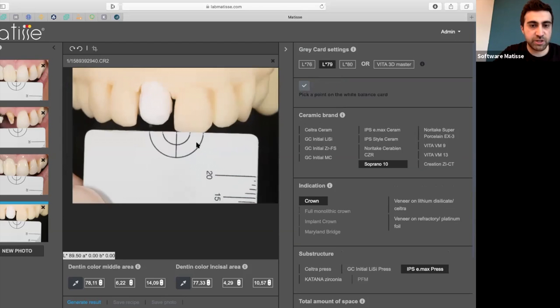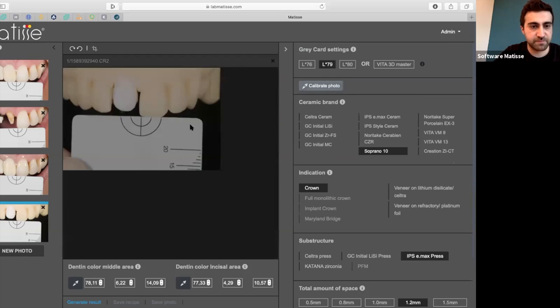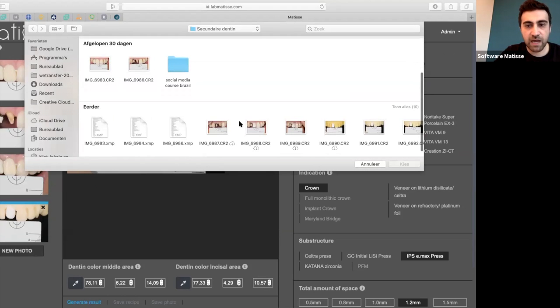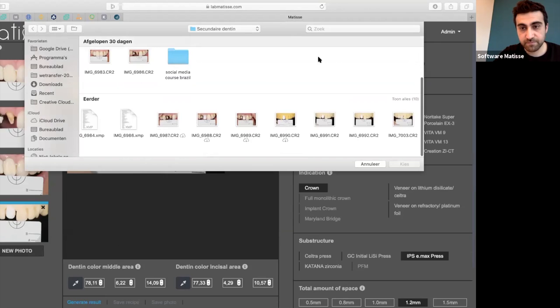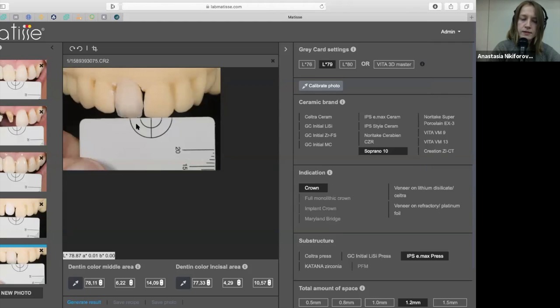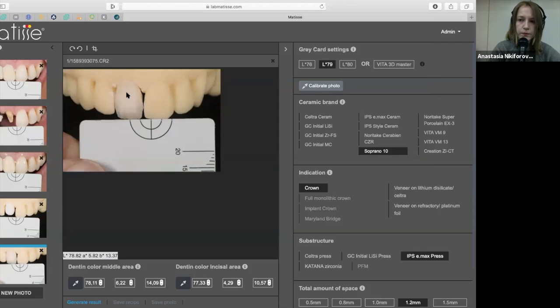So this picture we just uploaded, we have to calibrate it. Then I'm going to upload an image after the first bake. When I compare the LAB numbers of my crown with the target tooth, they have to match. My crown has a luminosity of 78.513.